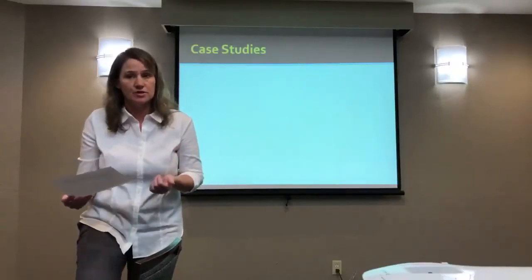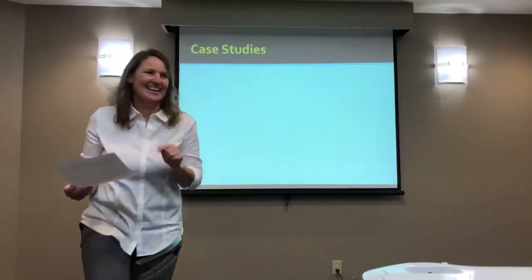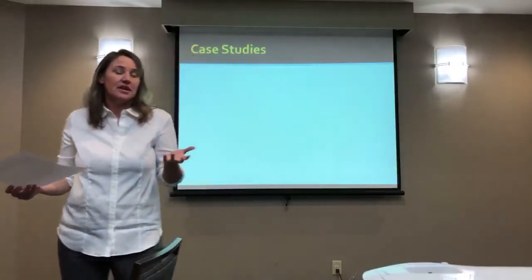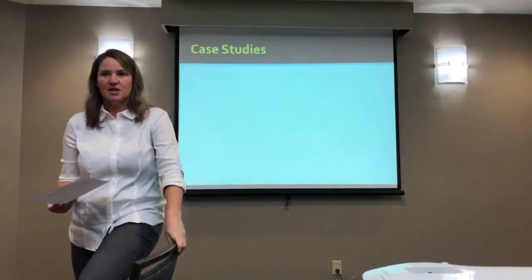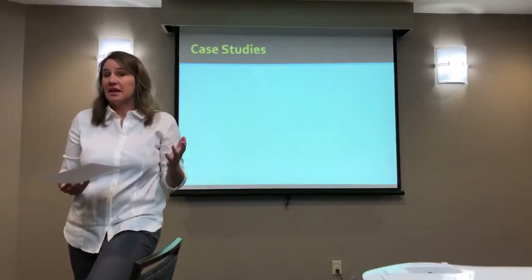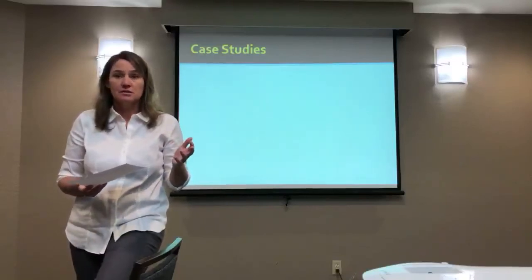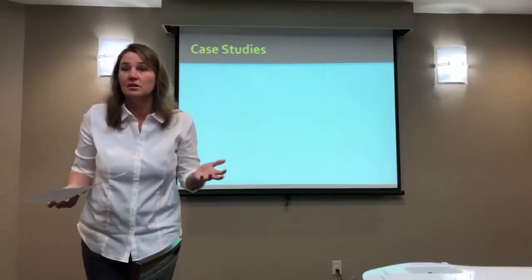Do they need ultrasound? You're going to say no, right? You're going to say no because I'm skeptical anyway. Is it going to be of benefit? Try it. And again, it wouldn't be my first choice. Okay, so my question is going to be, I'm going to look at things like probability. And I'm going to say, okay, this is a young, healthy person who has a very high probability of getting better. They don't need it. Why would they need ultrasound?